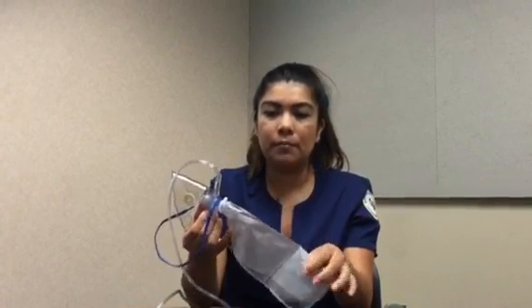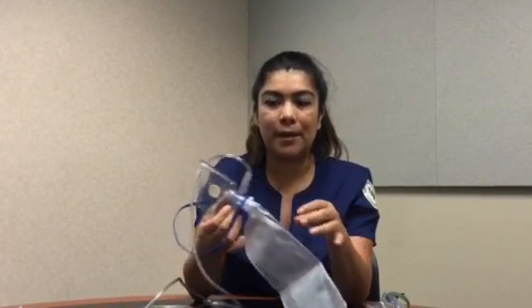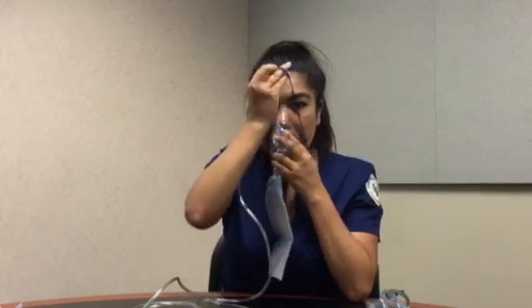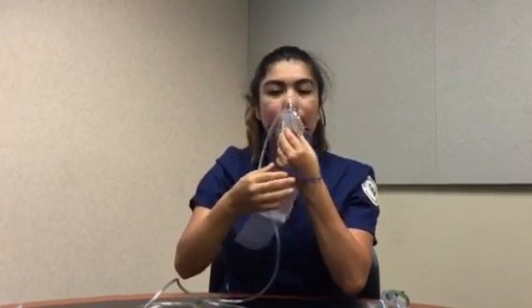Therefore, you want to make sure that you replace it and place the proper mask on the patient with a working reservoir bag. And it's the same thing: you just place it over the patient's face and nose, and put the strap over, just like this. Then to remove it, you just hold the mask in place and remove it just like that. This is the reservoir and non-rebreathing mask, should I say.